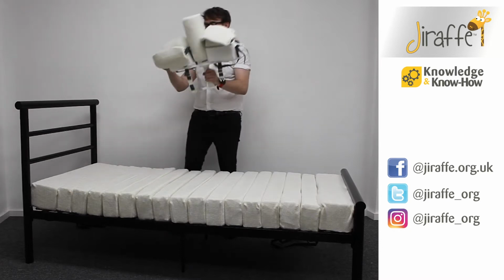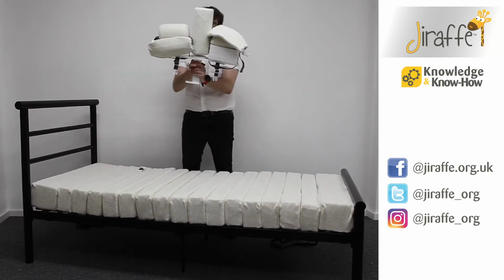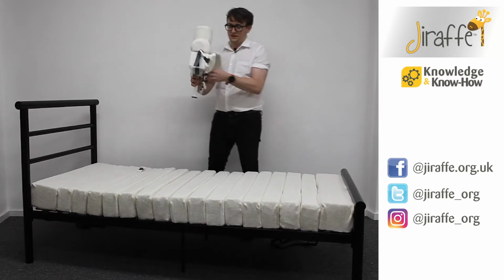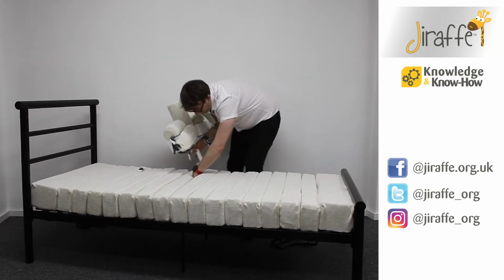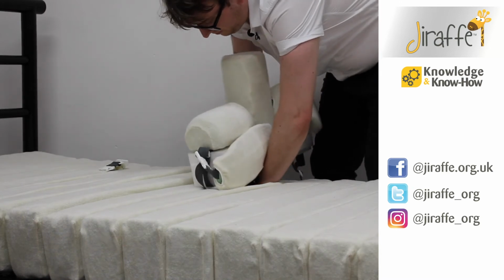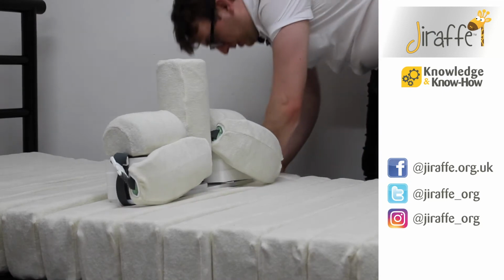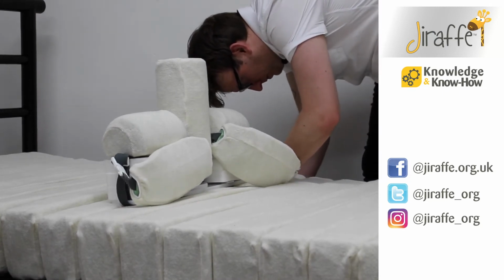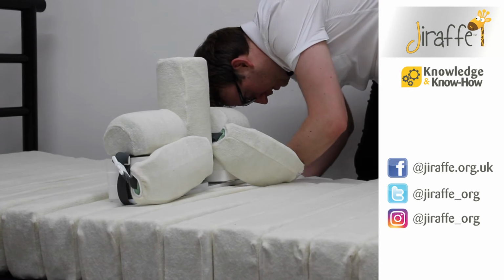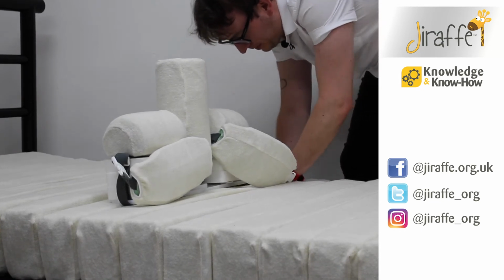We can then unclip the other, which we will use in a second. And then we're going to fit the T-roll itself through the alleyway. Once the T-roll is in position, we can add the next locking foot, and then attach the clip.